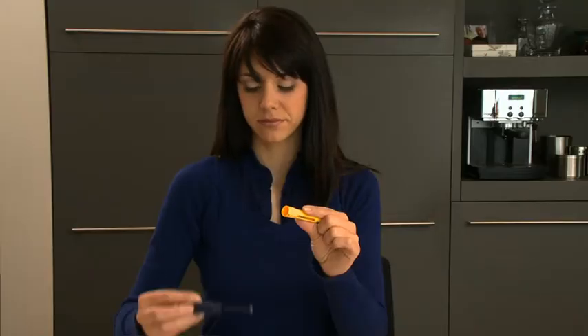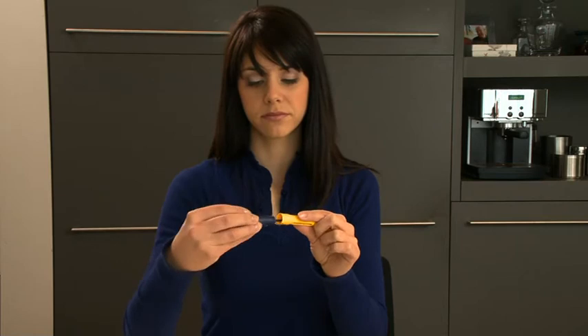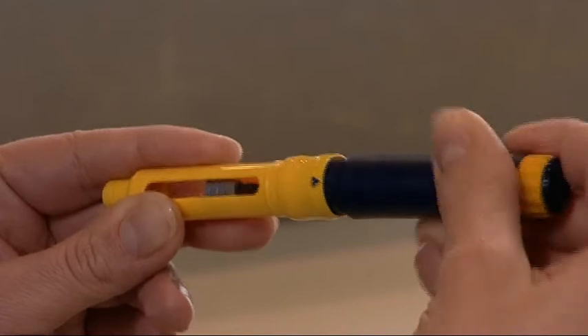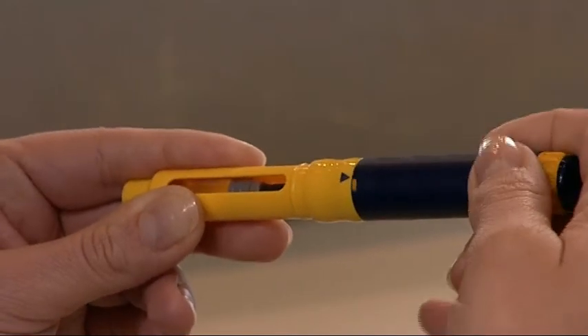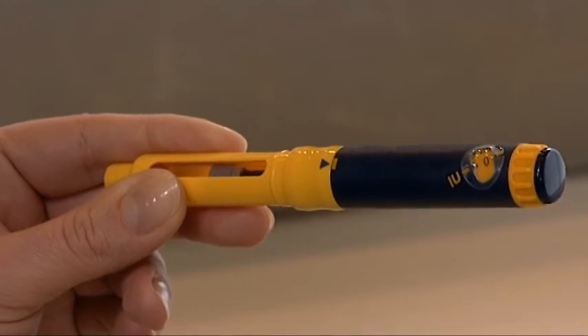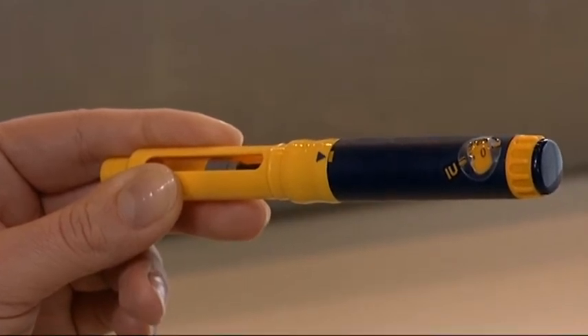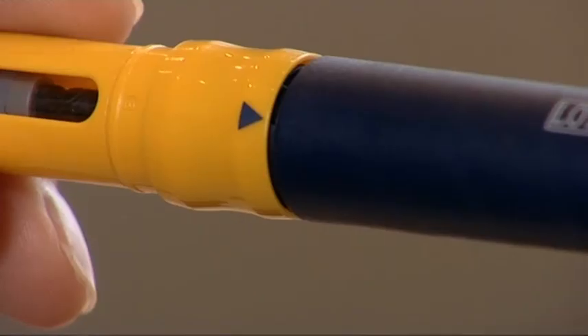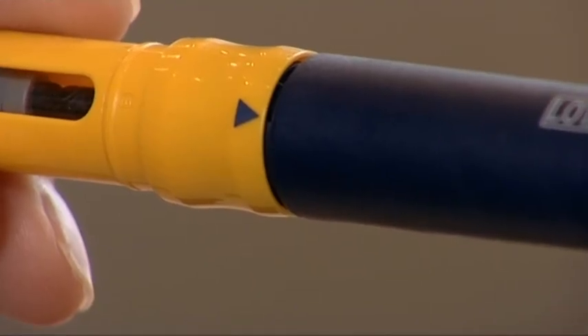Lower the pen body into the cartridge holder. The black rod must press against the rubber piston on the cartridge. Screw the cartridge holder towards the body, making sure that the arrow falls within the aligned mark. The arrow on the cartridge holder must point to the middle of the yellow alignment mark on the blue pen body. Check that there is no space between the body and the cartridge holder.